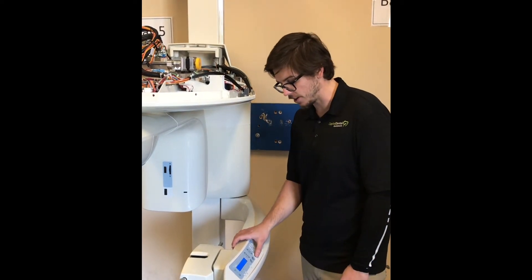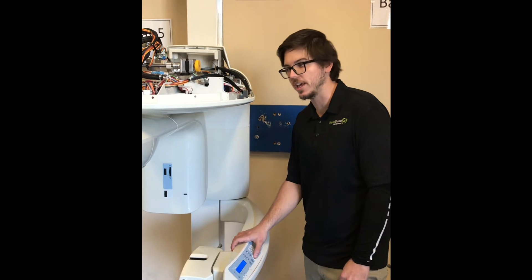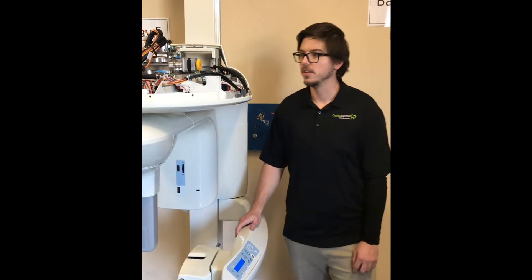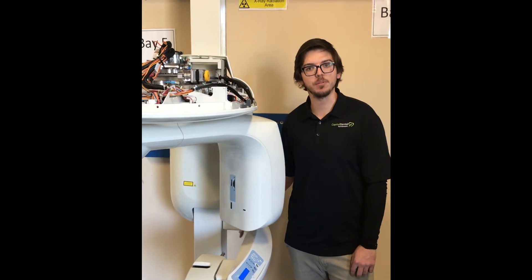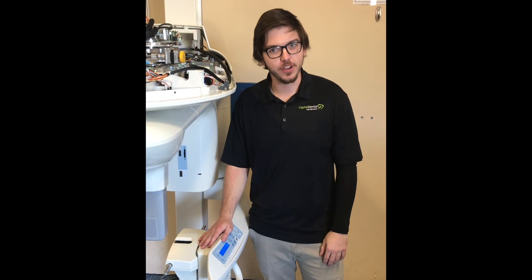Once you've successfully done that, you're going to hit the rotation or home button once again. And when that successfully finishes, your machine will be ready to acquire an image. That is how you successfully clear out an E42 error.